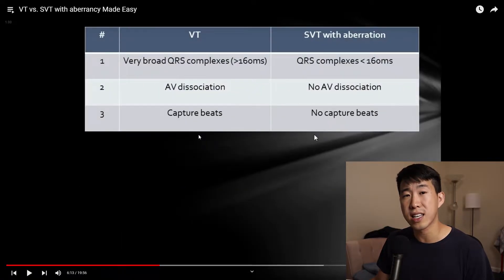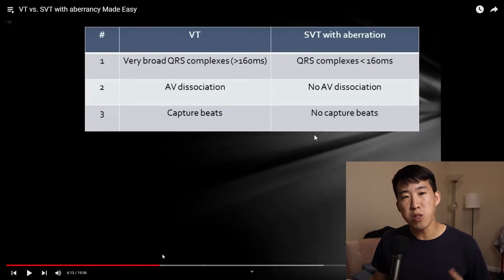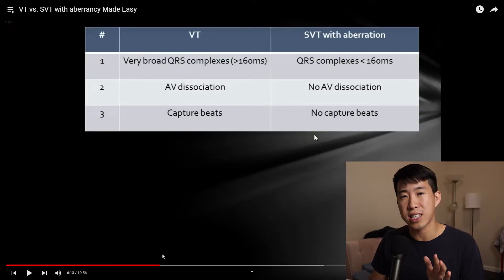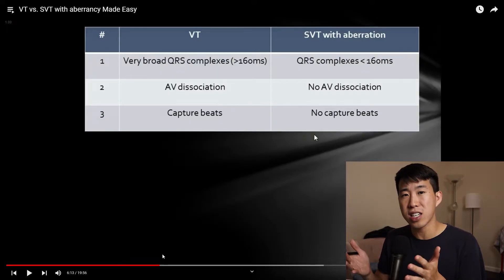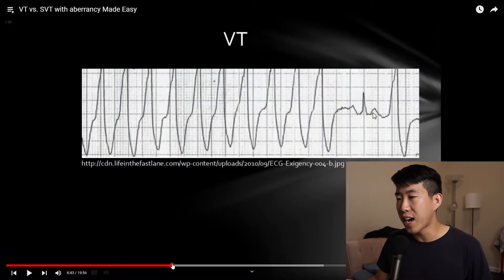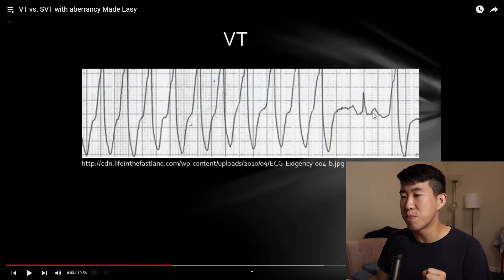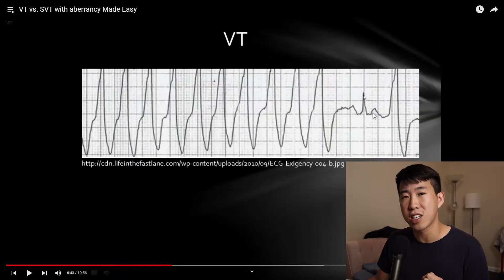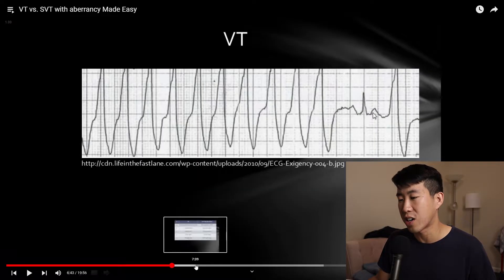The next thing to look for is capture beats and fusion beats. Capture beats are when your sinus node fires and is able to capture the ventricle at exactly the right timing, producing a normal depolarization. So in ventricular tachycardia, you'll have all these bizarre wide QRS complexes, and then suddenly you see a normally conducted QRS complex — that is highly suggestive of ventricular tachycardia.